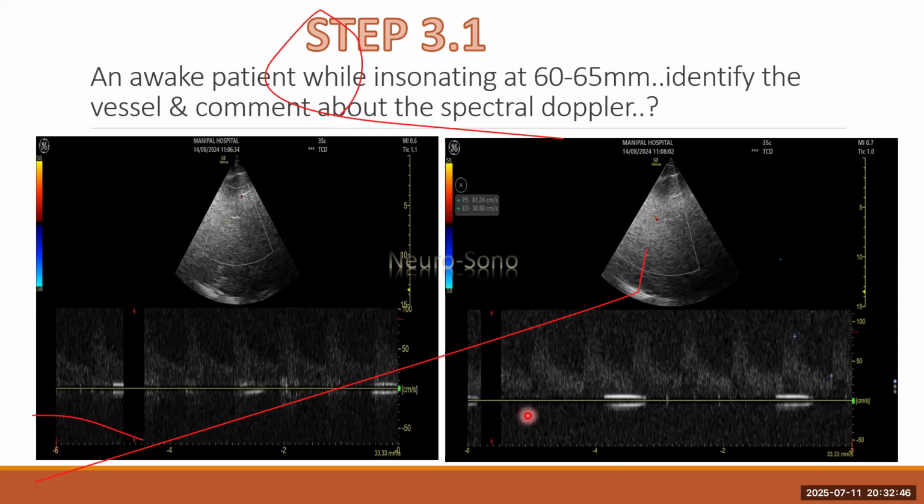So this is when the patient was speaking, okay? He was intermittently trying to communicate something. That was the reason why I put an awake patient. So this is how, in step 3.1 in that figure, or in the steps of identification, we saw that we need to identify what are the artifacts and what are the real turbulence. This was the reason why I put up this slide. We need to identify what is a turbulence and what is an aberration or an artifact. Okay. So identifying the error and the artifact is step 3.1.